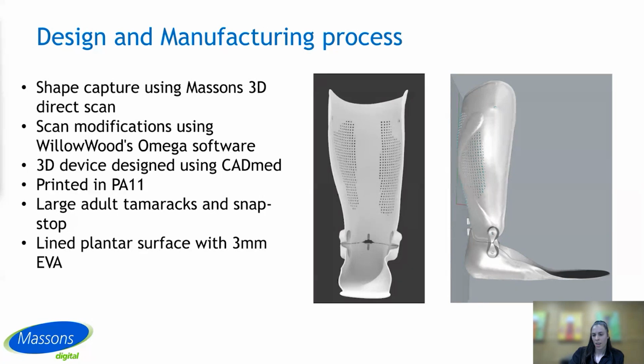With little changes needed to the design, the most difficult part of this process was actually incorporating the joints and keeping them well aligned to each other and to the model, because back when this was done, CADmed was more or less in its infancy. Since then, we're very happy to have worked closely with them to develop the software to make it much more functional. And now, compared to then, it would be a much simpler process.